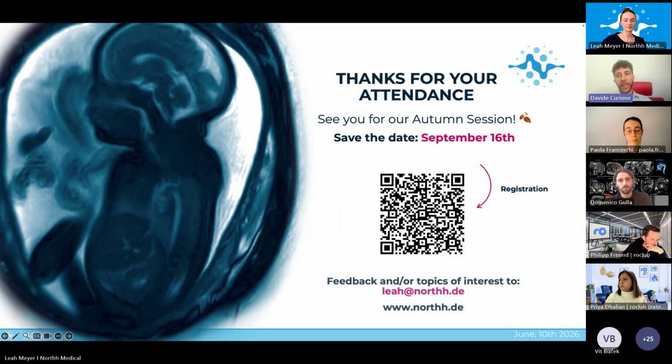If you can wait until the fetus is at least 30 weeks, the third trimester is the best time, because the fetus would be in position, would move less, and the heart would be big enough to be studied. Otherwise, it becomes a nightmare. We tried, but it's very difficult before 30 weeks, at least in our experience. Yeah, that's what we also recommend. Agree, gestation week 30.